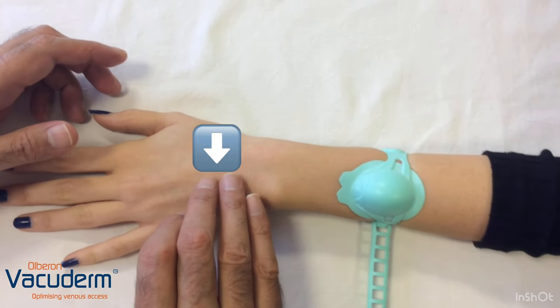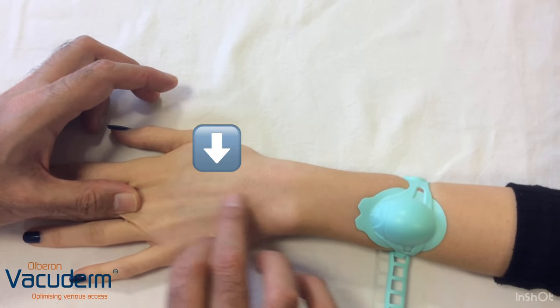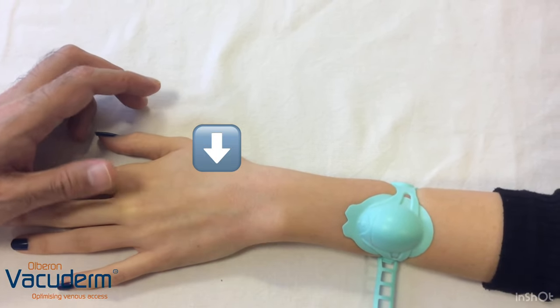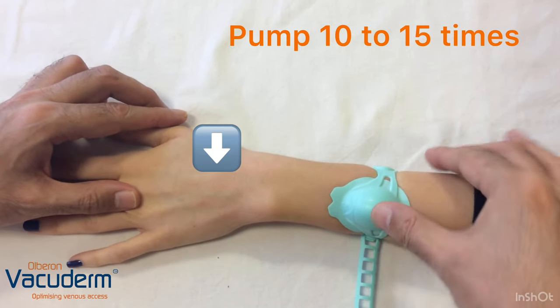We are seeing the small vein here in the back of the hand distending with the tourniquet effect. Now we can add to that effect by pumping the dome.